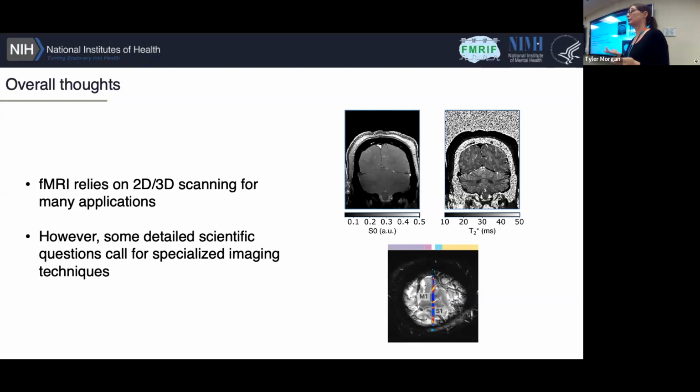And these are a couple of the tools that we talked about today that are interesting for doing very, very specific experiments. You would never choose to do line scanning if you cared about network processes that were happening across the brain. You can't, it won't give you that. But it can give you some very, very detailed information about specific experiments that you might want to do. And the same goes for tensor imaging. It's a more generalized case, but at the same time, tensor imaging has capabilities to actually resolve things that not all imaging types are capable of, or at least not in this case.